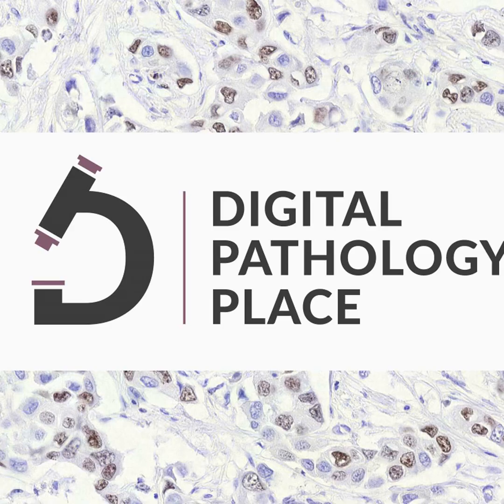End of side note. Despite the significant capabilities of tissue image analysis, it's crucial to remember that this powerful tool is designated to resolve specific narrow tasks. The process demands upfront investment in model or algorithm development, requiring the defined task of the tissue image analysis solution to be well outlined at the project's inception.